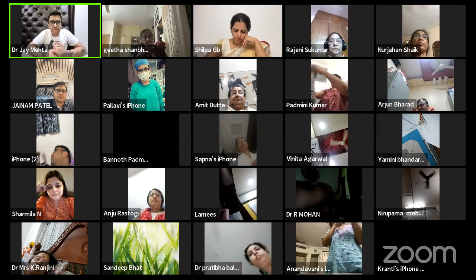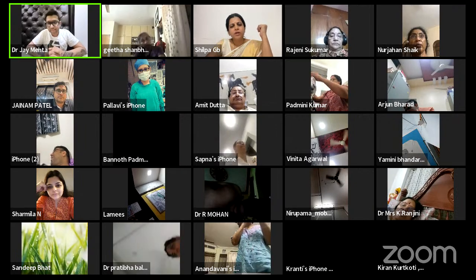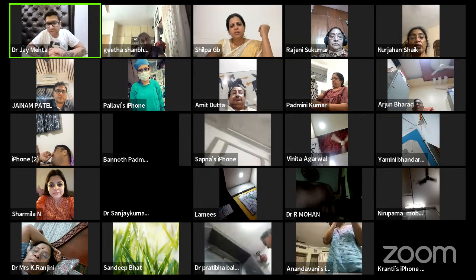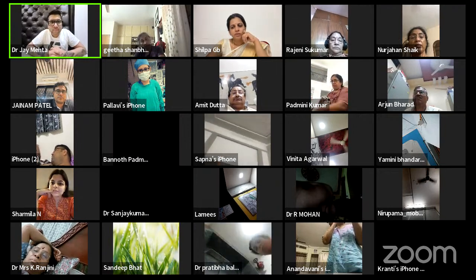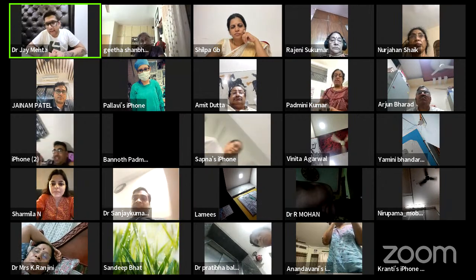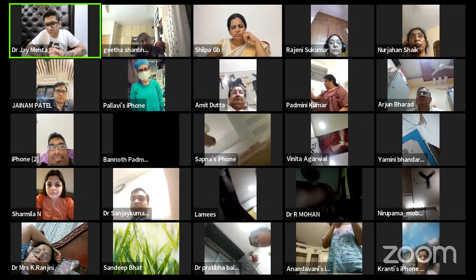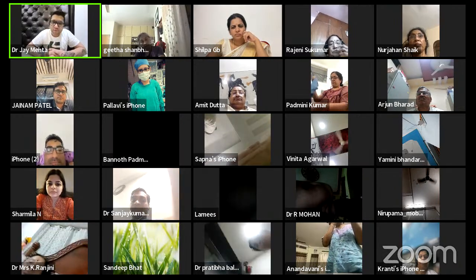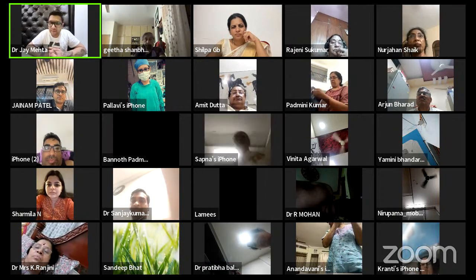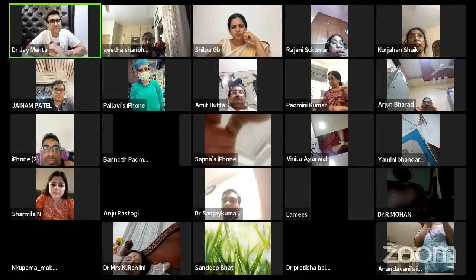So these fibroids that you remove, the myomectomy hysteroscopically that you do, always do you do it in a single sitting, double sitting? When is the time? All single sitting. Everything is single sitting. I use normal saline bipolar resectoscope. I don't use glycine at all. There is no glycine available in my hospital, just like how there is no vasopressin. So I don't use that. I use bipolar resectoscopes. It is the standard of care. It is safe. And once you finish the learning curve, it is extremely easy to do it.